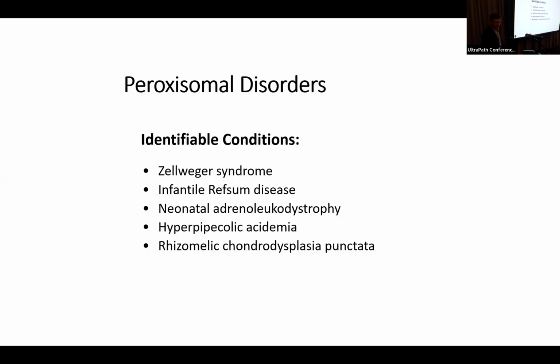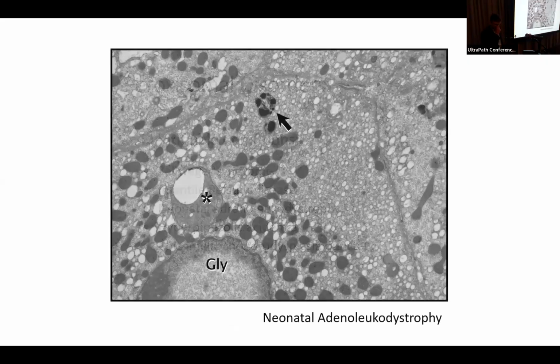So with the peroxisomes, here are disorders that all have either absent, reduced, or abnormal non-functional peroxisomes. Some of these do not cause much of a diagnostic dilemma because a neonatologist can identify a peroxisome phenotype for these kiddos. However, sometimes patients are less affected, and achieving a diagnosis can be a little bit more difficult.